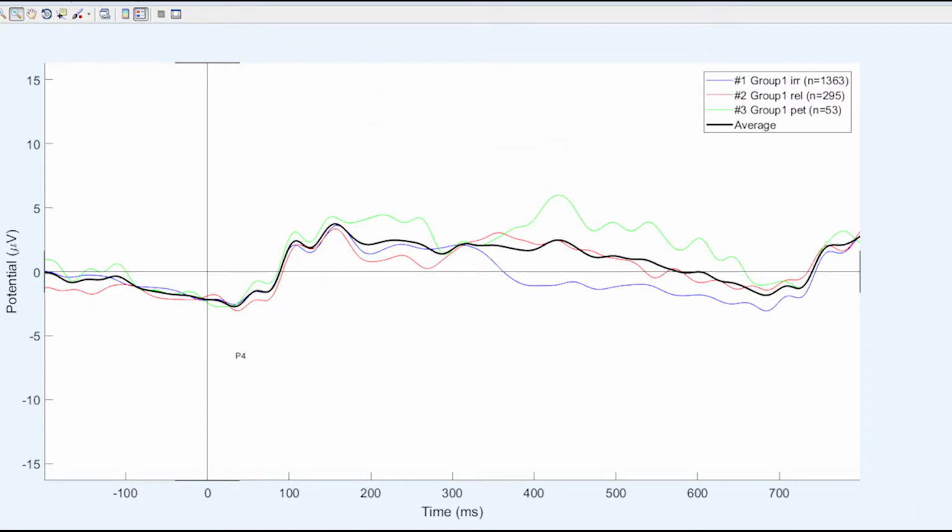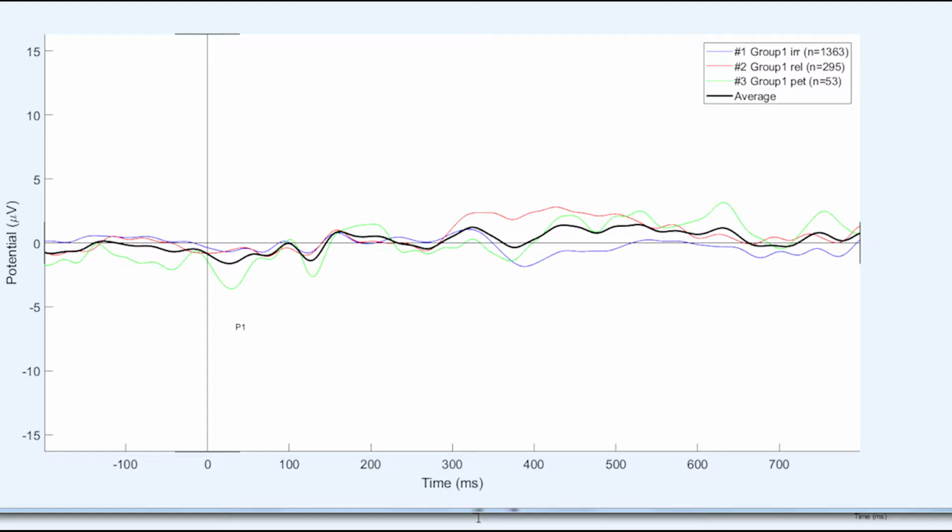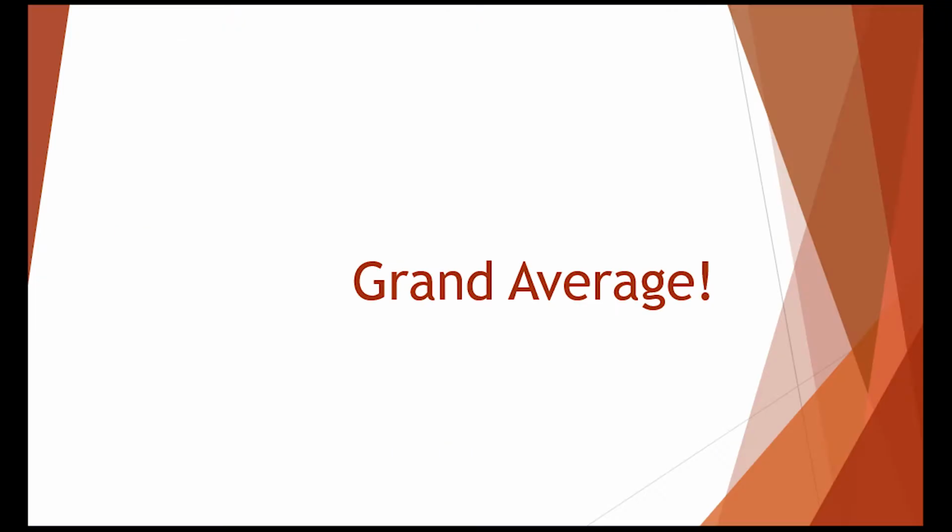As you can see from the following plots, the lines representing the type of stimuli run a similar track and then begin to diverge. This may be due to the psychological processing stages. The separation begins generally around 300 milliseconds, and therefore this may be pinpointed as the time in which the brain recognizes the stimuli differs from one another and each has a different meaning. P1 tends to occur simply due to the process of light in the brain. These findings stated previously were simply a single subject EEG analysis, but now it's time for the grand average.